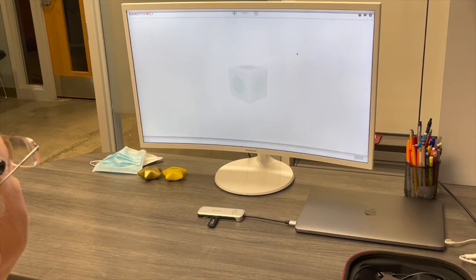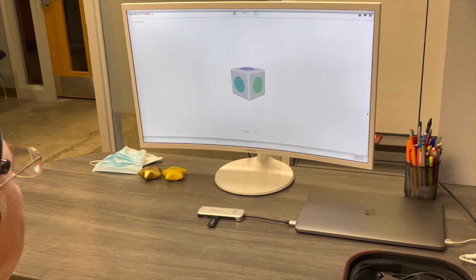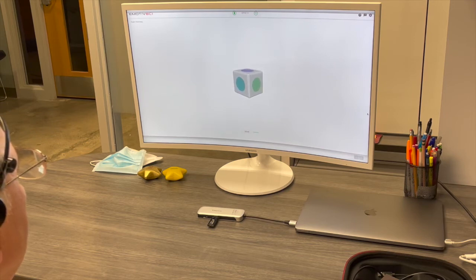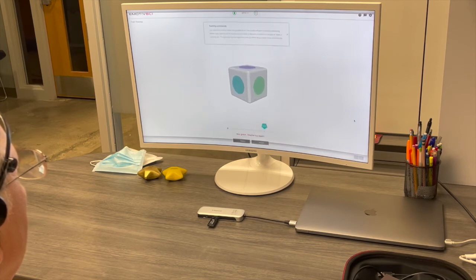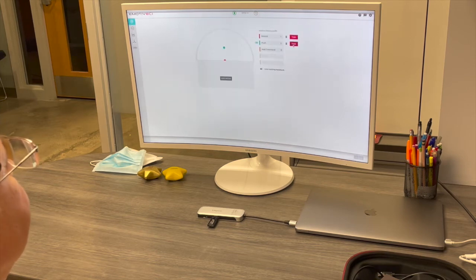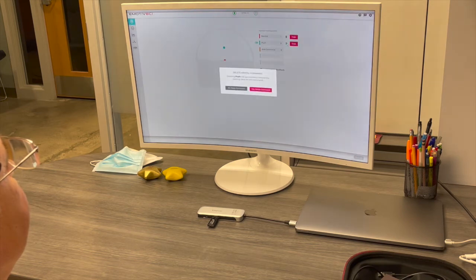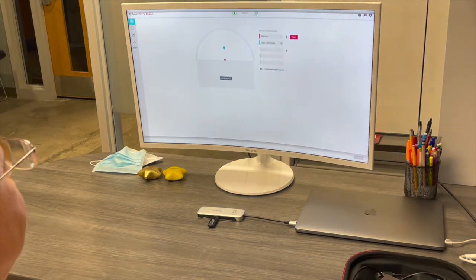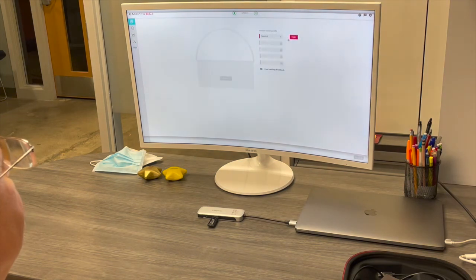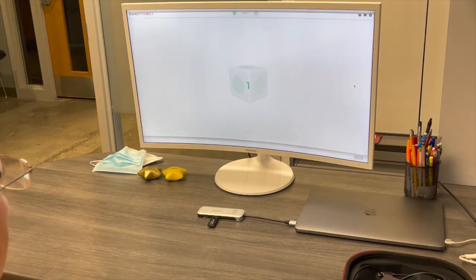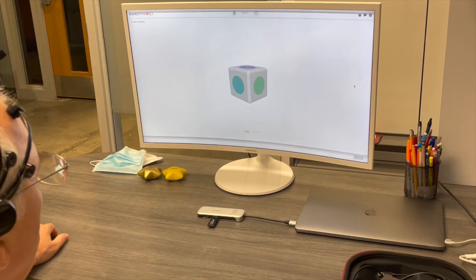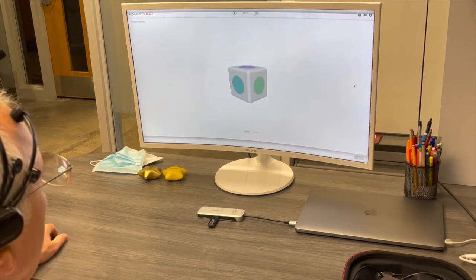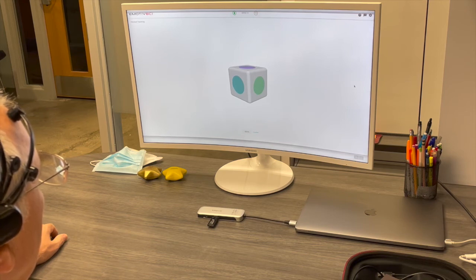And you should probably redo the training many times so that you are very confident that you always focused on the command that you have. You also have a meter that will tell you how well you did. And you usually want to see a very high quality for your training data. If you're not happy, you can delete and restart the training at any time and obtain a better quality data.